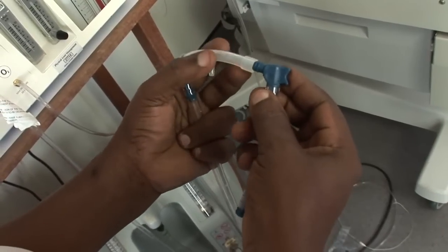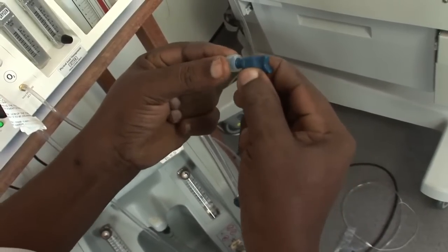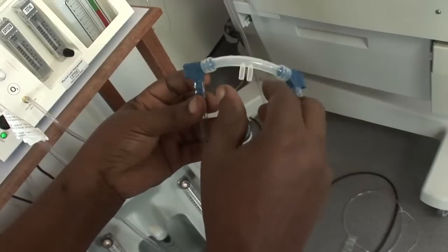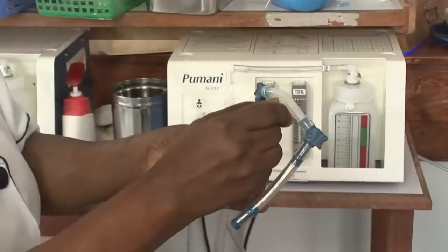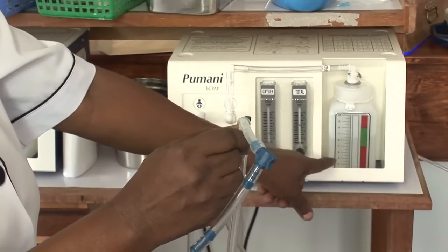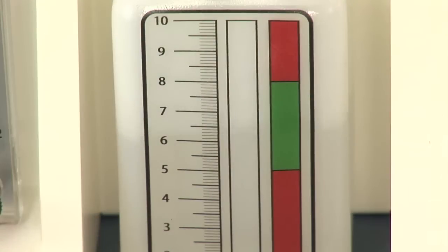Now assemble the prongs at the end of the tube going to the baby. This baby will use the smallest size. Then check that everything is working by pinching the prongs — this should make the water bubble. It is very important that the air and oxygen are already flowing before you attach the baby; otherwise you will block their breathing.